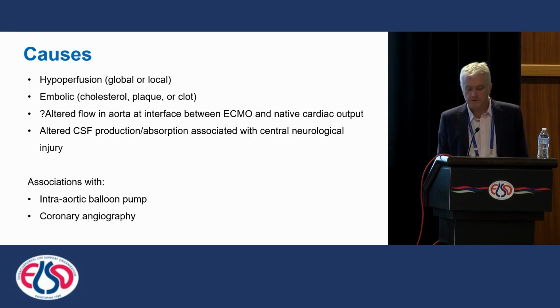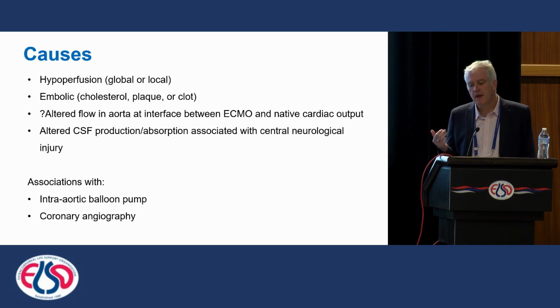What are the causes of this? So hypoperfusion I put at the top of the list. Certainly in aortovascular surgery, the most common time you see the MEPs go, and I'll come and talk about MEPs, is where we have a problem with perfusion, either due to hemorrhagic shock happening in the patient or cardiogenic problems. Or it can be local. It may be that the surgeon has not reimplanted those lumbar arteries when they're doing their thoracoabdominal aneurysm repair.